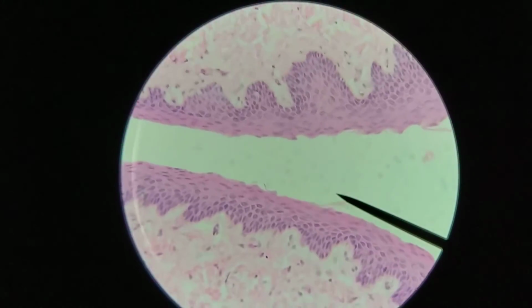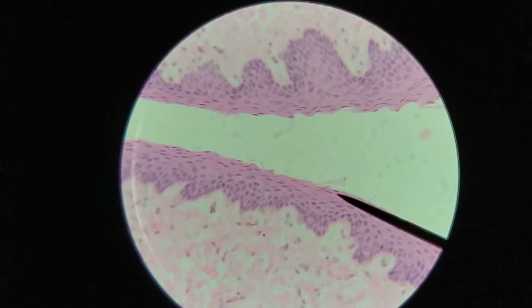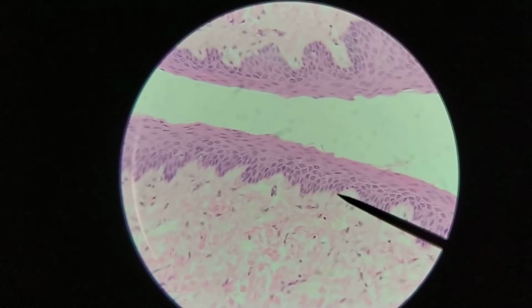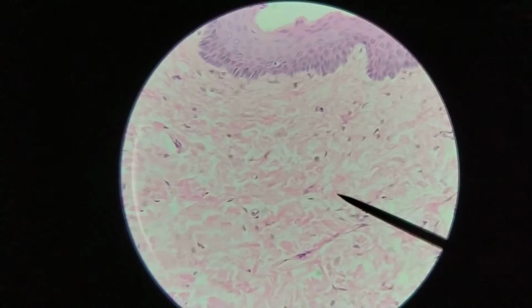At the surface, we can clearly see a stratified squamous epithelium. If you look at the top, the surface layers have a squamous appearance, and we have multiple layers. Beneath that, we have some connective tissue. This is the lamina propria of the tunica mucosa.